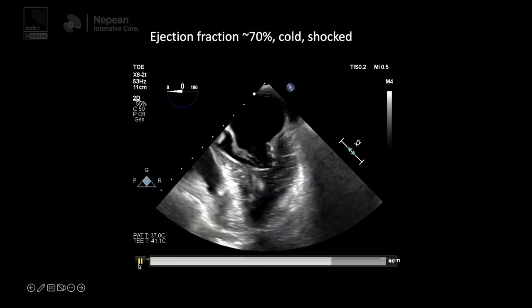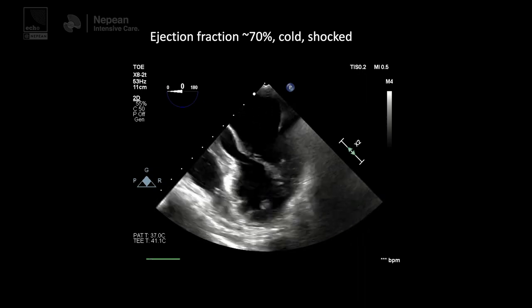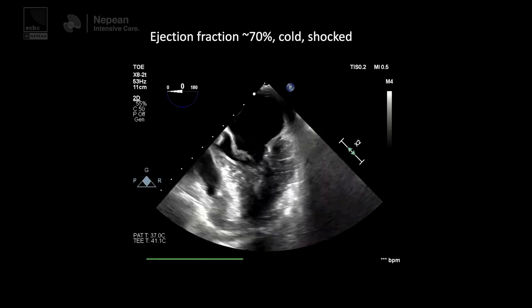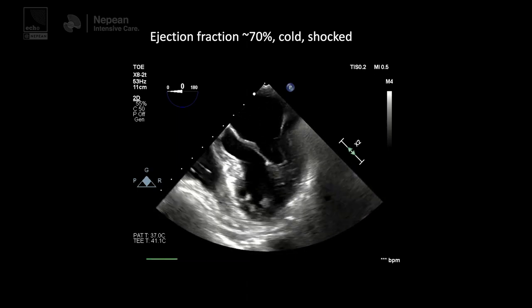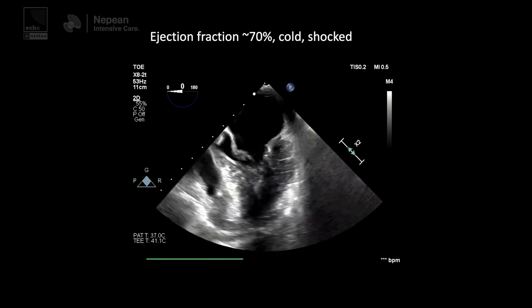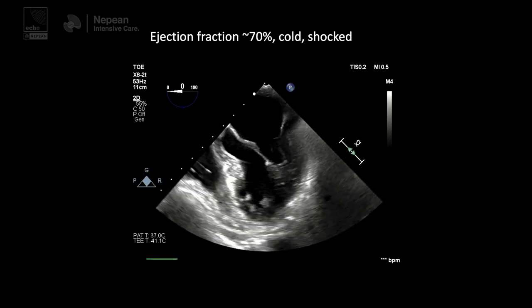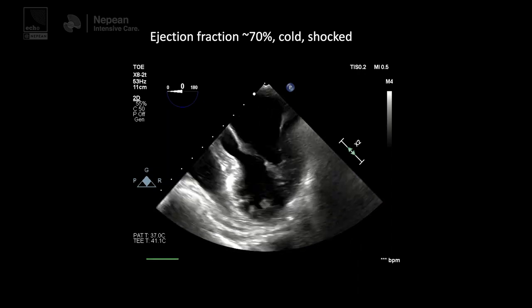One of the classic ones — we see this not infrequently in the ICU, we've had a few in the last month — is where using extra modes on advanced echo with color and thorough assessments is critical. We have a TOE image here: a mid-oesophageal four chamber view where the left ventricular systolic function looks cracking, hyperdynamic, too good — almost end-systolic obliteration of the ventricle. You would worry about SAM and LVOT obstruction. But the key thing about this patient is their cardiac output was terrible, coupling ejection fraction with cardiac output is really emphasized here. Unless you're very experienced you might not notice that structure flicking in the left atrium.